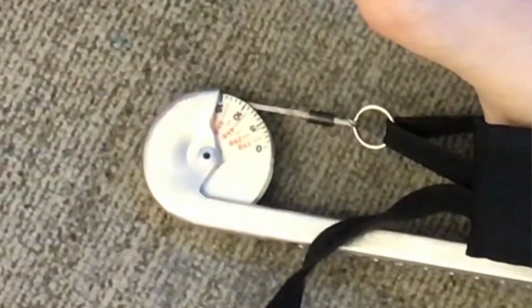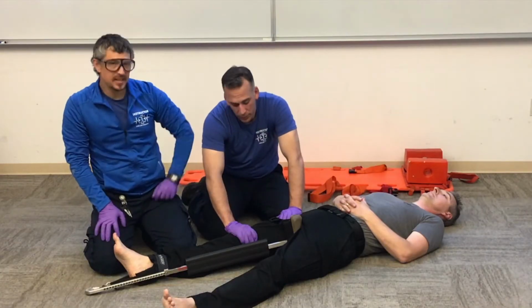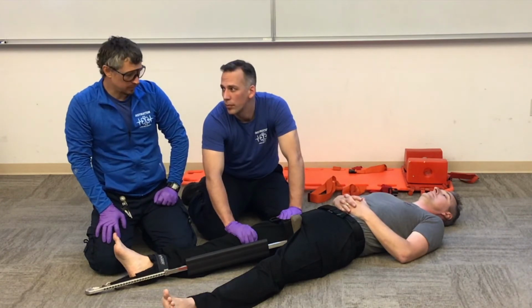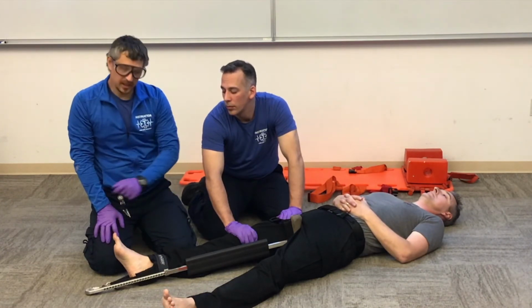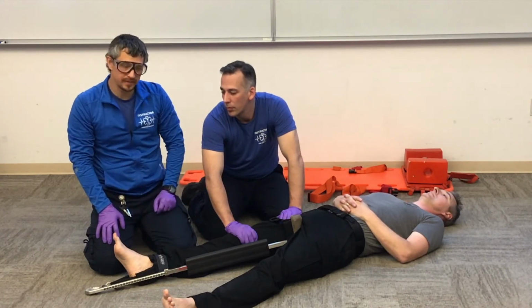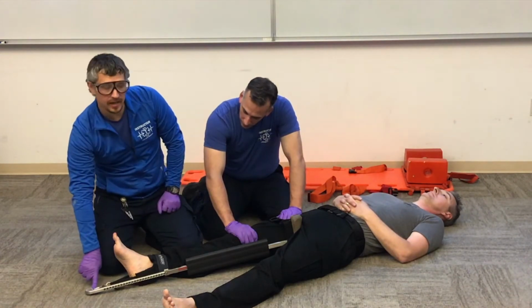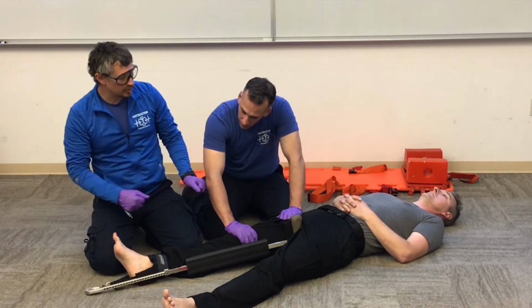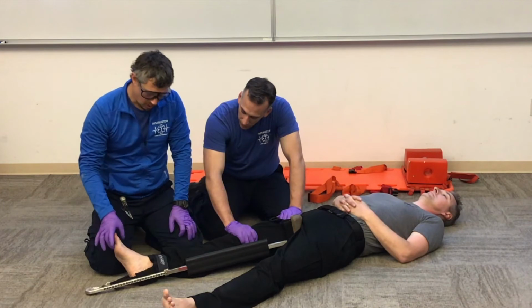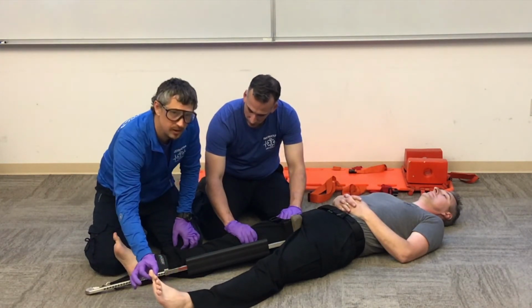We want to pull no more than 15 pounds or 10% of our patient's body weight. Chandler is more than 150 pounds, so I'm just going to stop at 15. If we have a device that doesn't have a scale, we can pull until our patient feels relief or until the injured extremity matches the good extremity.